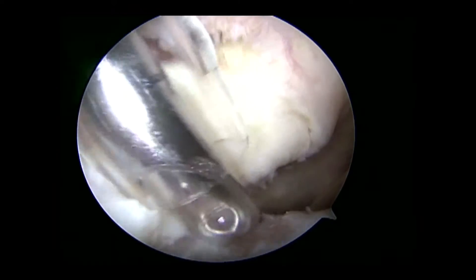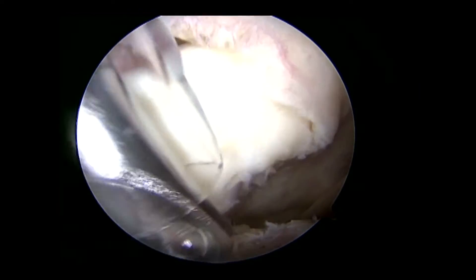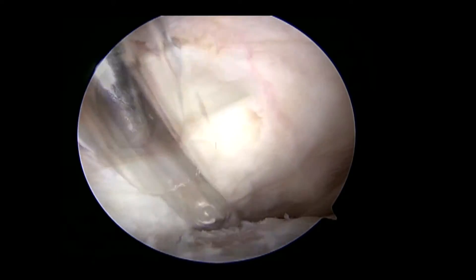A shaver and rasp are used to debride the reverse Hill-Sax lesion and prepare a bleeding bony surface for subscapularis remplissage.